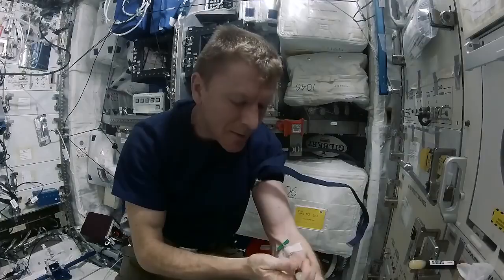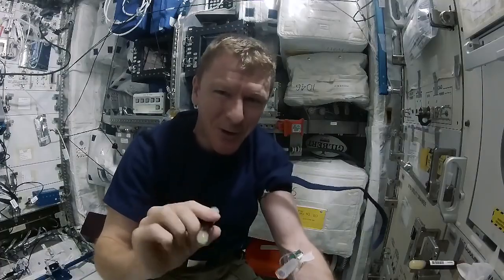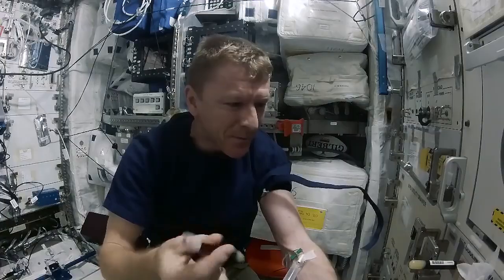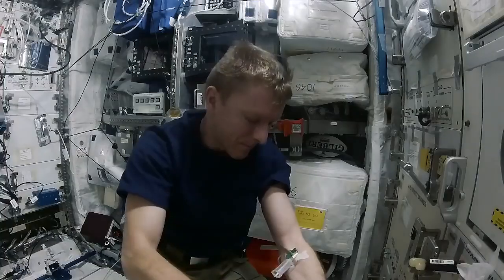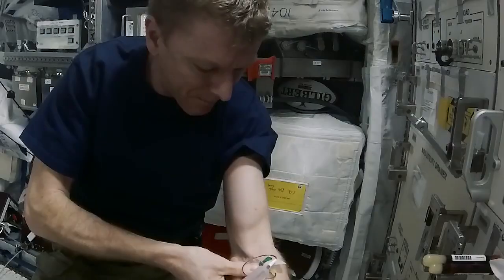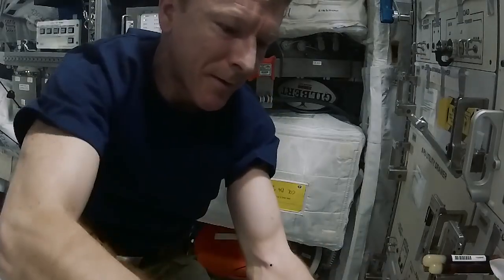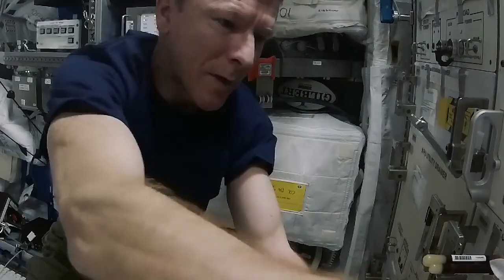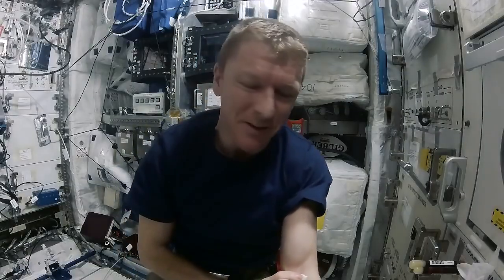Sometimes you have tube failures and they don't draw up much blood, but thankfully both tubes have worked this morning so I don't need any spares. I'll now release the tourniquet and then ready to withdraw the needle. Needle's out — safe the needle, it's nice and safe — and then a quick bit of pressure.